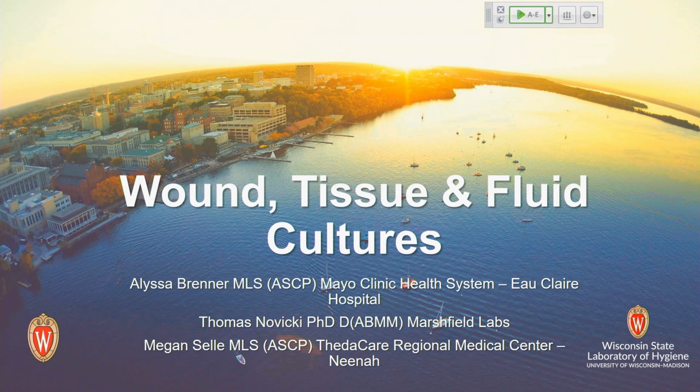I think if you decide to start working the aerobe first, regardless if it's 1 bench or 2, what we do now is we use the aerobe to inform working up the anaerobe. So we'll look and say, oh, they got 2 or 3 things out of the aerobe. Well, it's been reported, the ID's out, the susceptibilities are out. But then we'll look at the anaerobe, and there's 3 or 4 things, and we don't even do the aero tolerance testing anymore. We'll just say this is a mix of bacterial organisms. We don't say anaerobes because we didn't do the aero tolerance, but we just say it's a mix. And that's really conveying the information that this culture's got a lot of things in it. So the aerobe has been worked up and we don't retract that, but at least it informs you on the anaerobe side.